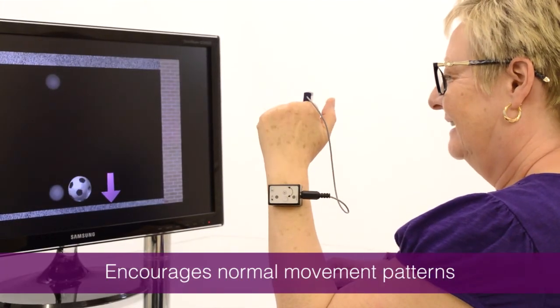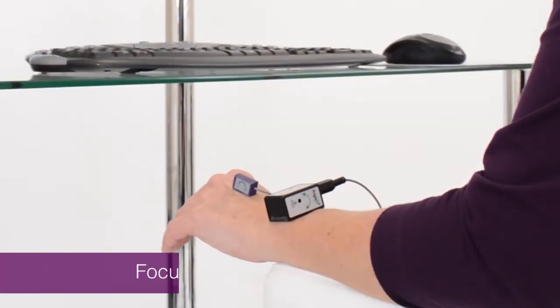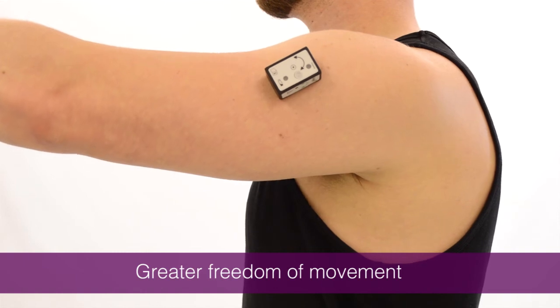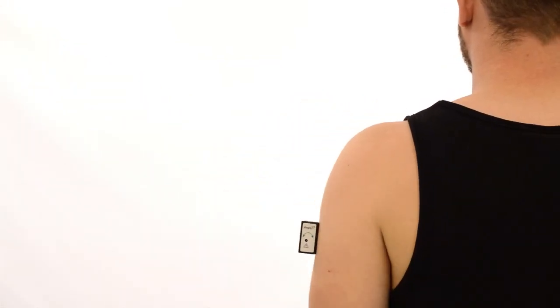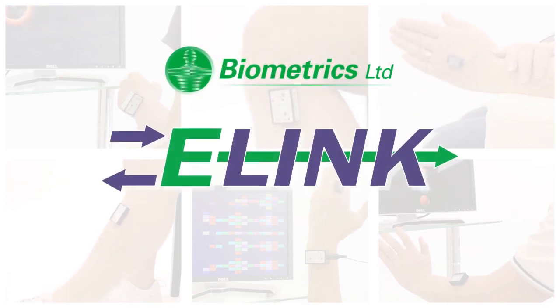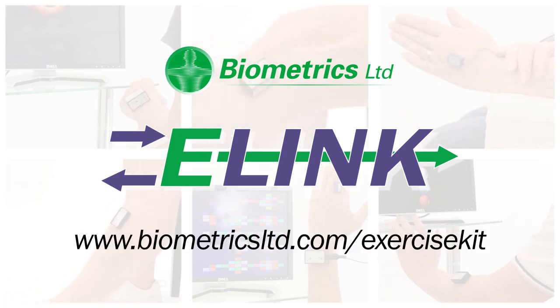AngleX encourages normal patterns of joint movement and discourages compensatory ones, totally focused on the individual patient. AngleX is the ideal choice for focused joint exercise. Designed by engineers in close collaboration with clinicians, E-Link has evolved into a well-recognised technology that has been used worldwide for over two decades.